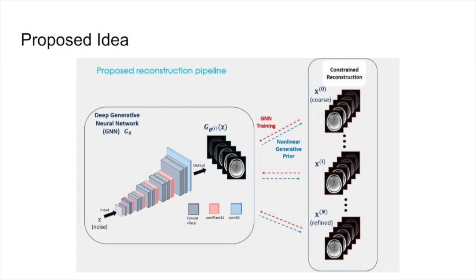Now, I would like to talk about the image reconstruction method proposed in this paper. First, update the multi-echo image created by the GNN. Next, train and fine-tune the GNN parameter using this multi-echo image. Through this process, the sampled image can be reconstructed.